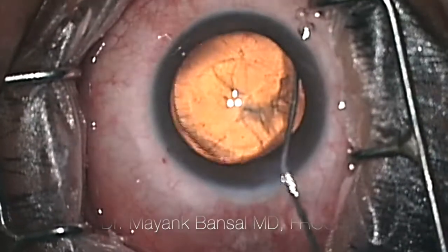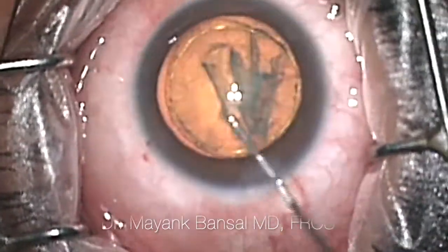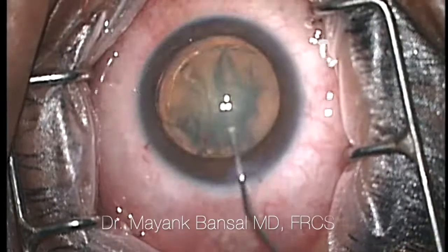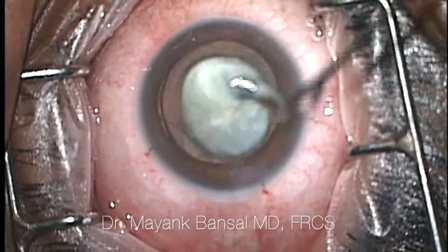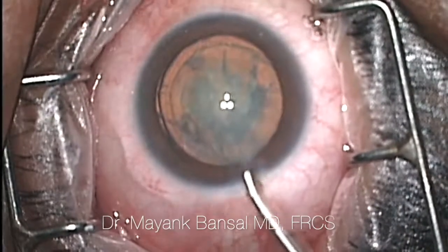Now here I'm making another incision for a side instrument. We then inject some fluid to separate the cataractous lens from the capsular bag, and after which we're essentially putting more fluid and doing as much dissection as possible — this is what we call hydrodissection.